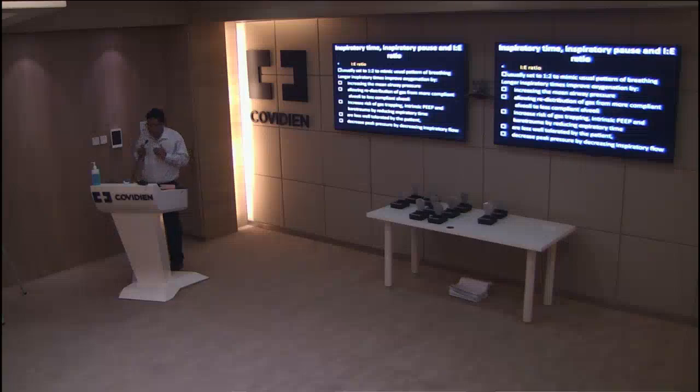Okay. IE ratio, like I told you, is usually set to 1:2, but remember, you keep it 1:2 because that is our usual IE ratio when you are breathing spontaneously. Inspiration takes 1/3 of the time, expiration takes 2/3 of the time. But like I told you, remember that the IE ratio is constant only if the patient's rate is equal to the rate that you have set. Once the patient's rate increases much more than that, then inspiratory time remains constant, but expiratory time keeps getting shortened. And progressively expiratory time gets shortened.